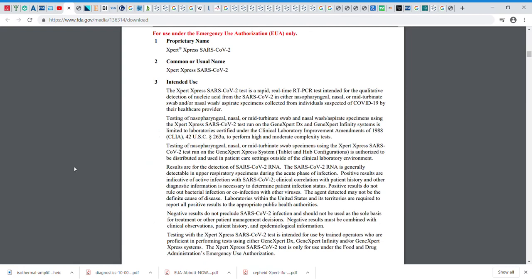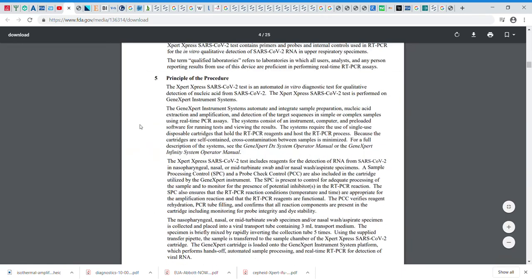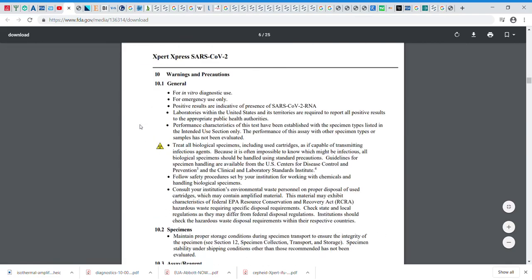real-time PCR, and they say, once again, it's qualitative, right? They're going to give you sort of a yes or a no, not going to give you the exact number. And they talk about the different ways you collect it. They have four different ways here. A lot of disclaimers, talking about principles, how you do stuff.